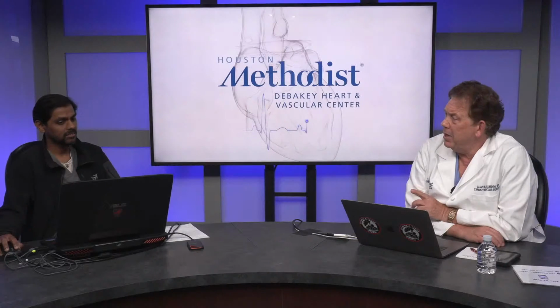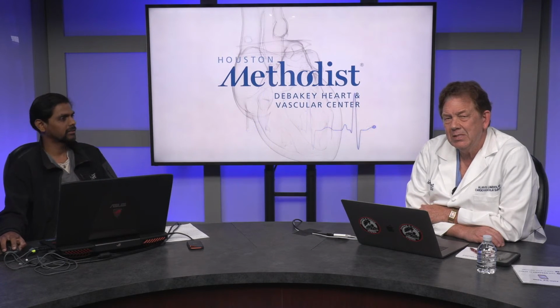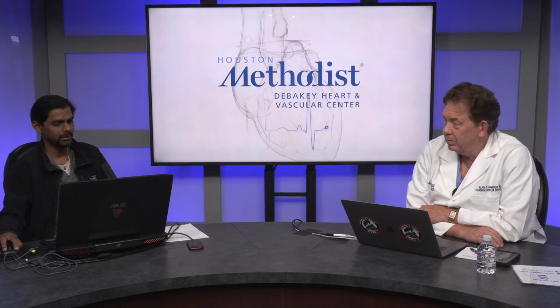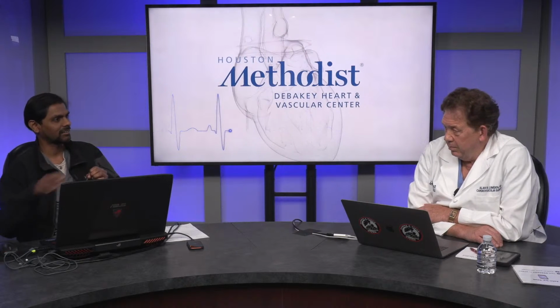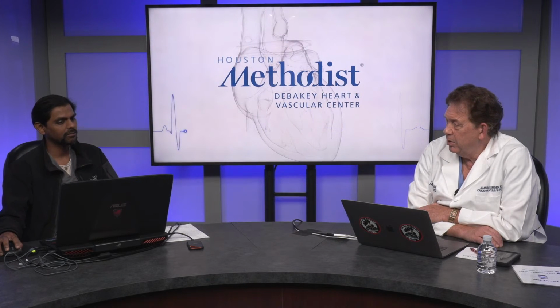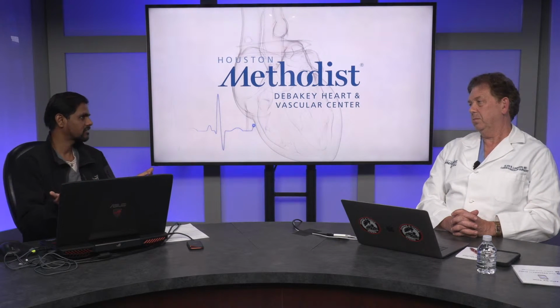Yes, but it is complex in dissections because there are multiple different flow patterns you're dealing with. For example, imagine the technologist doesn't know, and to be fair to the technologists, they don't know if the aorta is dissected. They place a region of interest in location 2, and if that aorta is dissected and we are looking at the false lumen, we are going to wait for contrast to arrive, and the contrast would be delayed, and then they would start the acquisition. The way we overcome that is to do a timing bolus and get a slice where we see both the ascending and descending aorta, and then check if there is dissection or not.